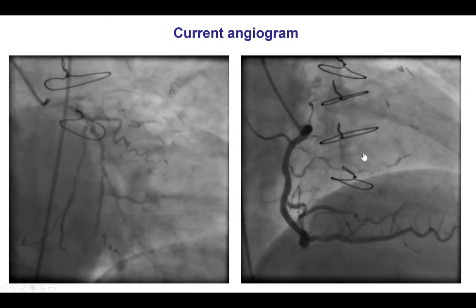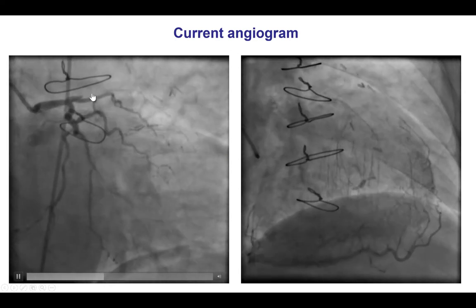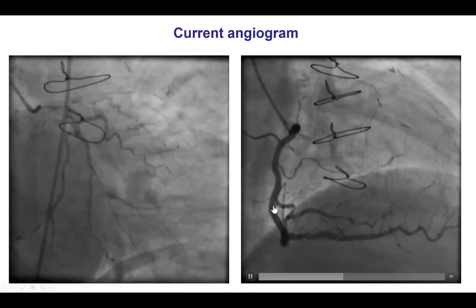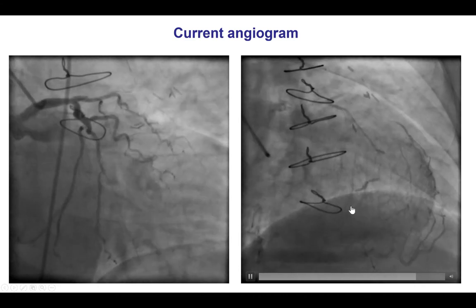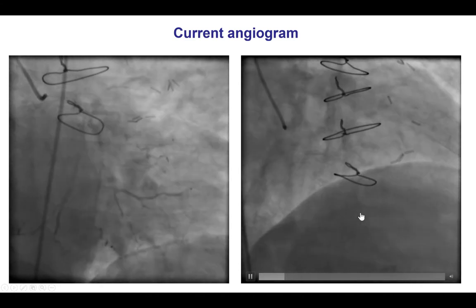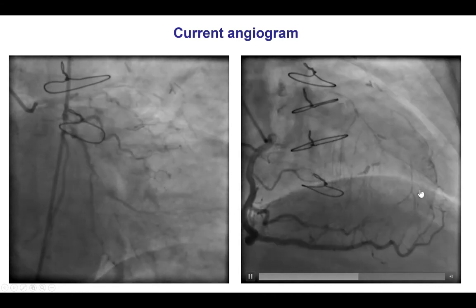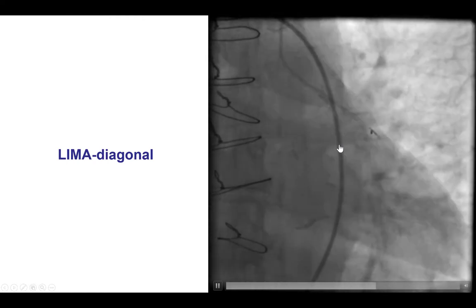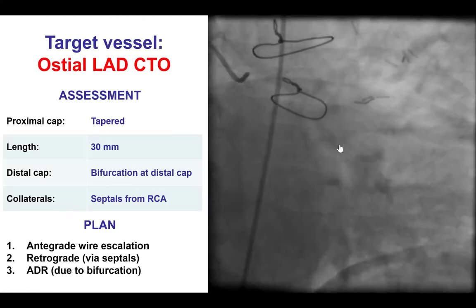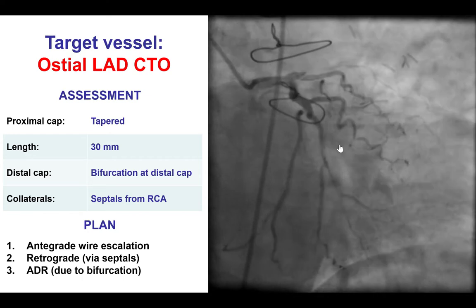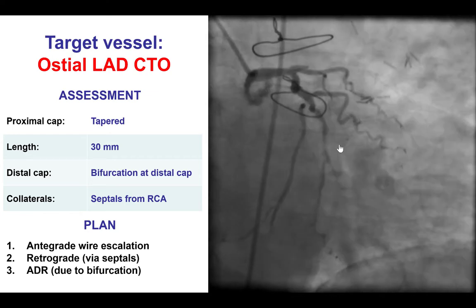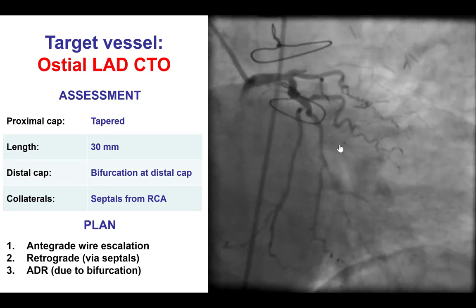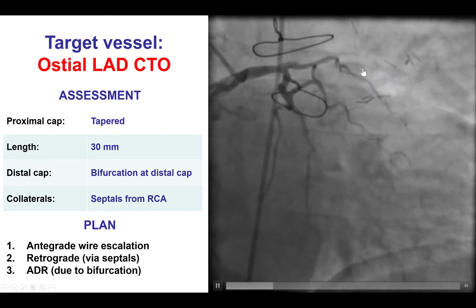In the current presentation, there was occlusion of the proximal LAD as before. There was some disease in the circumflex and the obtuse marginal branch, and the right coronary was patent and giving a good collateral network to the LAD as well as the diagonal branch. The LIMA was occluded with essentially TIMI-0 to TIMI-1 flow into the diagonal branch. Therefore, the decision was made to proceed with PCI of the LAD as well as the diagonal bifurcation, which is complex because there was a bifurcation on the distal cap of the CTO.